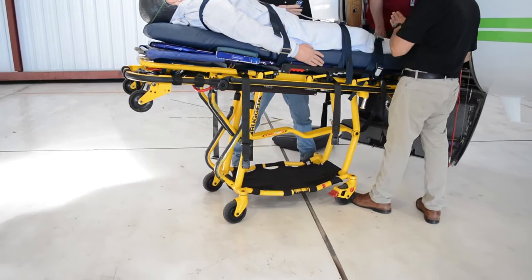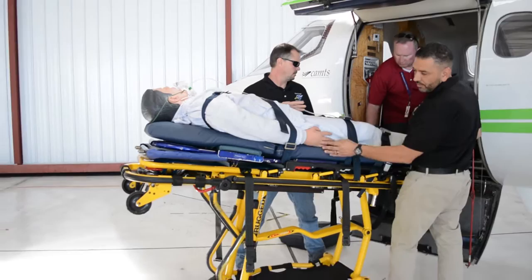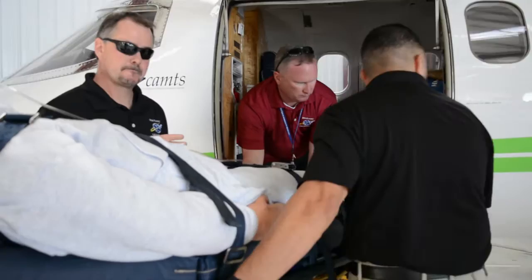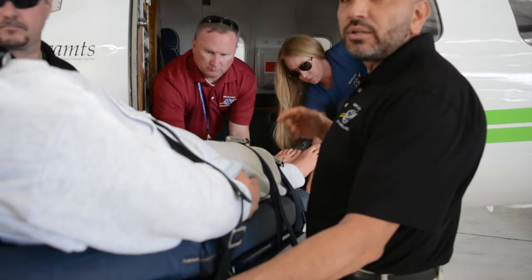We're going to make sure that we're verbalizing to each other when to lift and if everybody is ready to go. That's probably one of the most important things, just verbalization on this loading. So once we're ready, everybody ready? Grab the blue. Nurses ready? So Corey's got the bottom side of the sled here, and that's important to make sure that she's able to lift on that. And we're going to be supporting, again, pointing out the door jams to the non-flight team so they're aware of what not to hit.